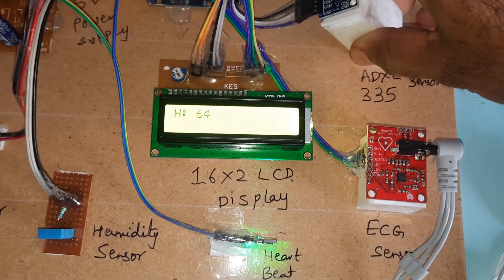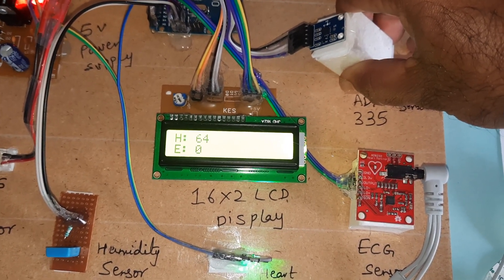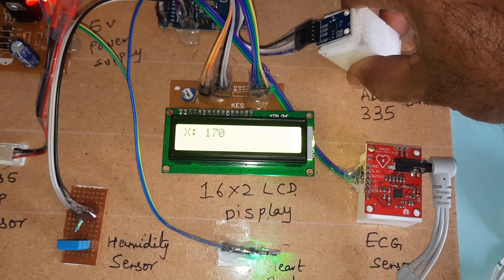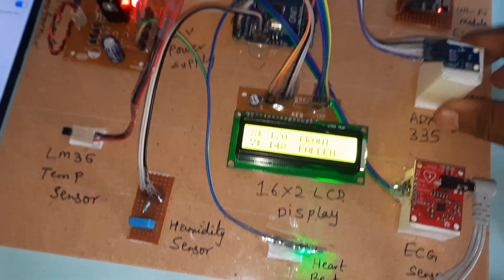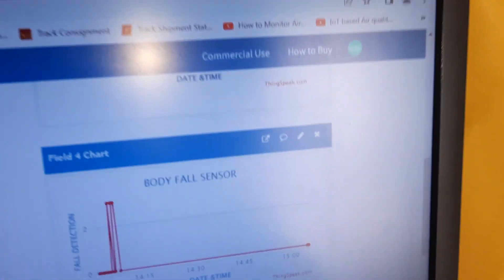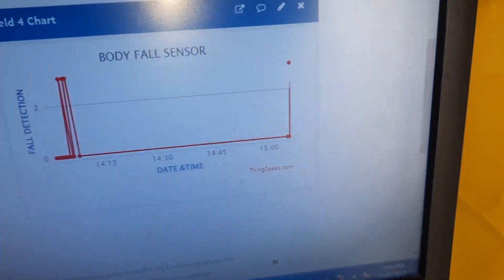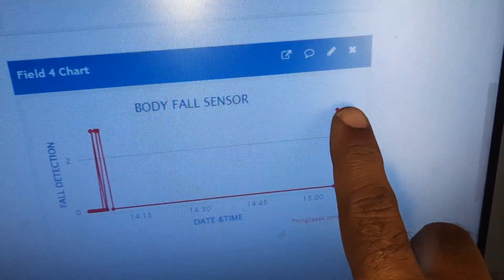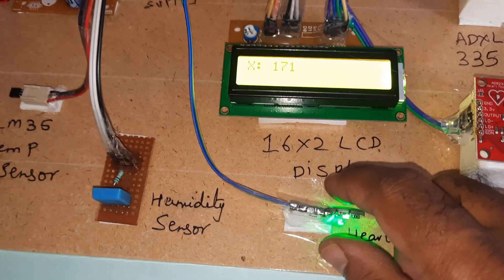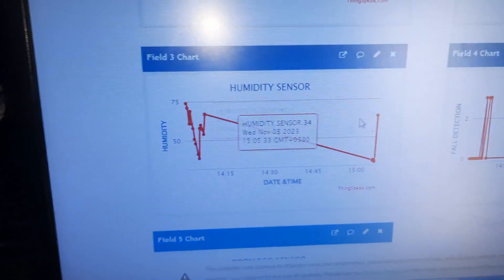Now demonstrating fall detection. 'Front fall in' is triggered and it will update front fall to ThingSpeak. When a fall is detected it shows 'front fall in'; when there is no fall it shows normal position. Whenever heartbeat goes to 90, humidity and temperature also update.